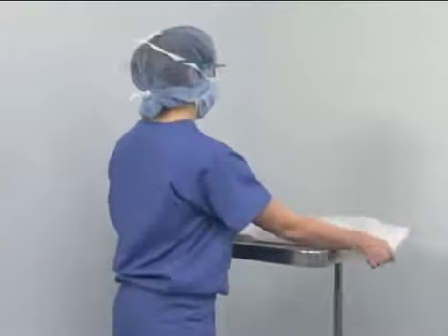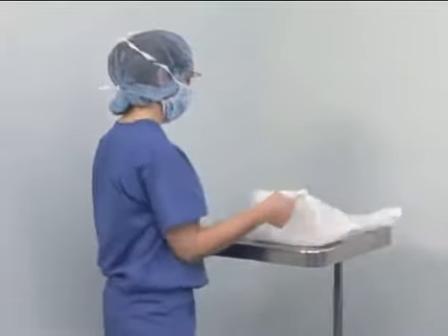Open the scrub person's gown and gloves onto a small table or mayo stand, not on the back table.